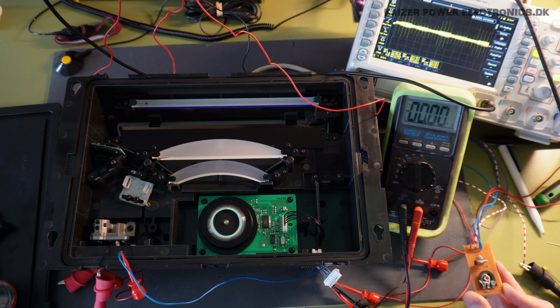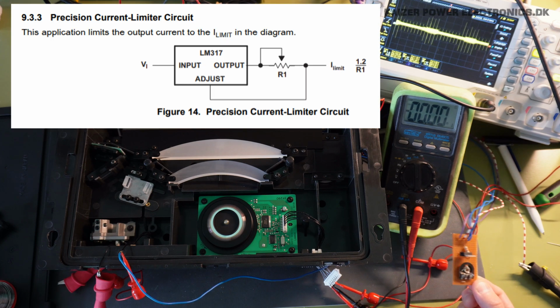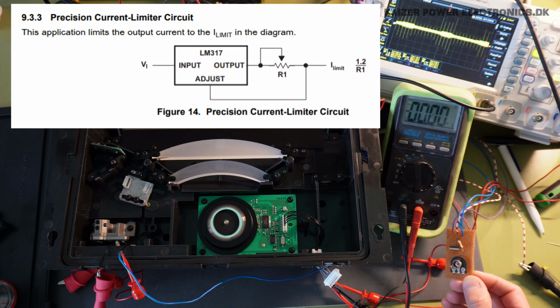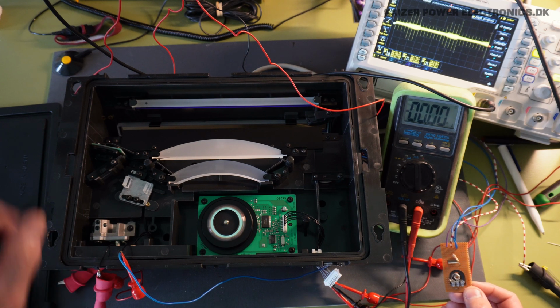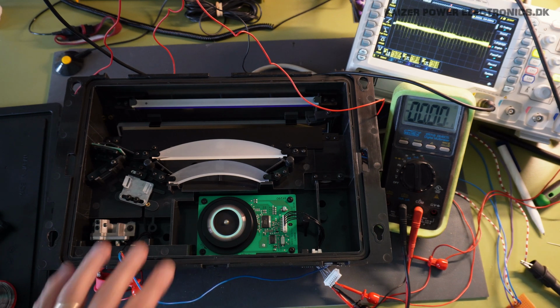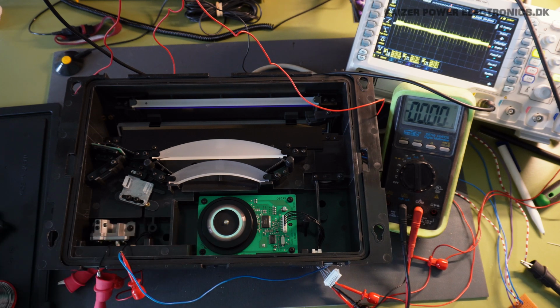I made a small, simple, constant current driver with an LM317. It's played really safe with a 1K potentiometer and 80 ohms here, so I can maximum supply up to 15 milliamps. I'm going to use another power supply for the DC supply to the diode over here and measure the voltage on a multimeter up here. I'm just going to play it real safe, really low power, just enough so we can actually see the laser beam being reflected on the motor, hopefully.